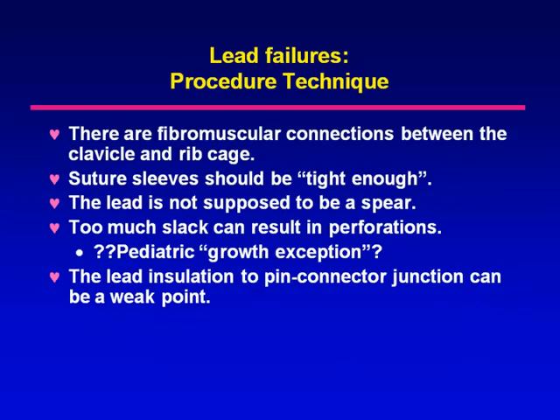So one of the things is, remember the famous subclavian crush problem. I'll show you some pictures. That's this one. Be careful about suture sleeves. You want to be careful not to tie them too tightly. Remember the leads in the pocket, and take it gently. Too much slack can actually result in lead twiddling as the heart beats, and it can promote problems.